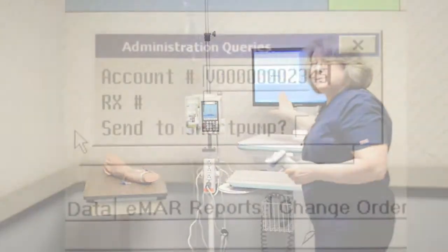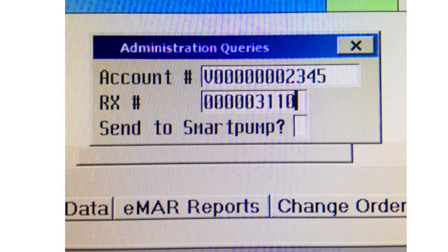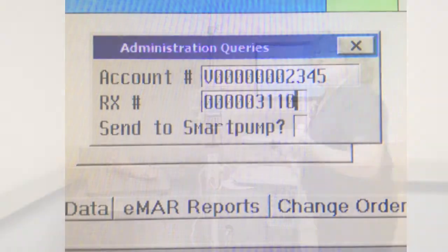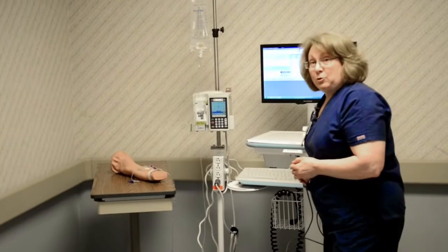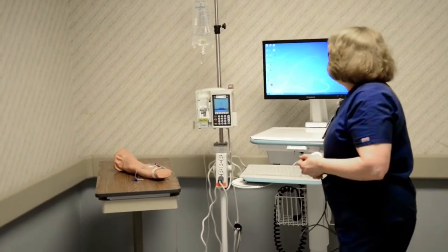I'm going to scan my medication. I get a pop-up screen. It defaults in the patient's account number. I hit enter. It pulls in the script number, and then it goes to a question that says, send to smart pump. At this point, if I'm going to use the smart technology, I'm going to press yes.